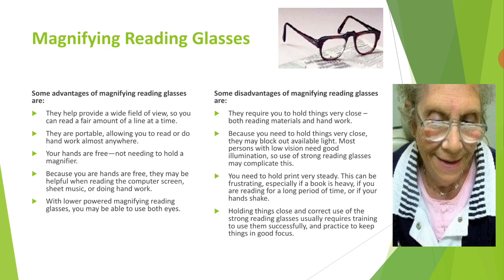Another magnifier introduced to you guys is magnifying reading glasses. Magnifying reading glasses allow an individual to read for a longer period of time. Using this, you can read for a longer time, without difficulty holding these eyeglasses, because you don't need to hold them.